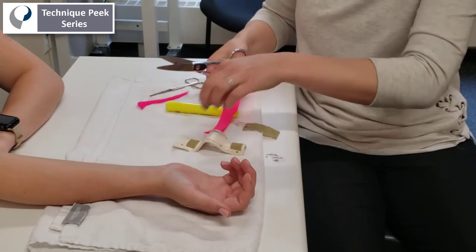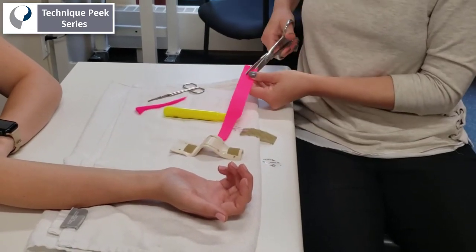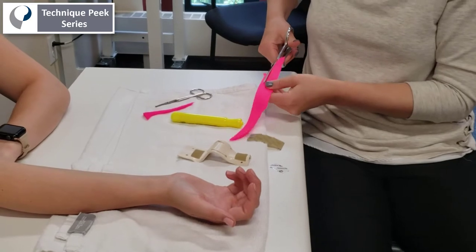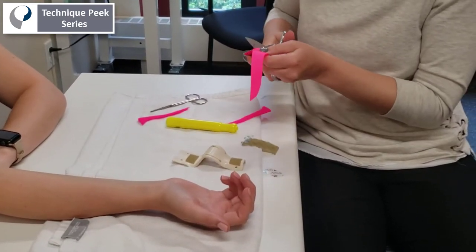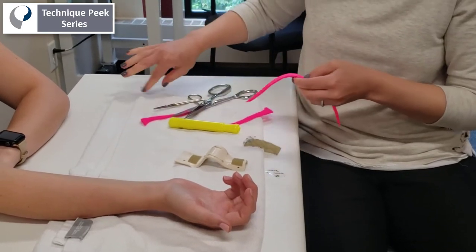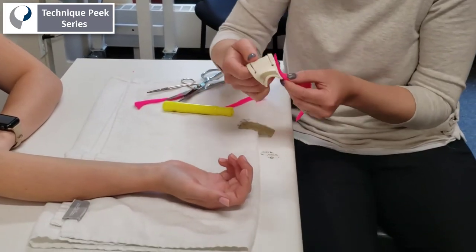I like this splint because once it's finished it's very easy for the patient to put it on and off using one hand, because once it's set up they only have to adjust one side of the Velcro strap, which you'll see more clearly once the splint is applied in the video.